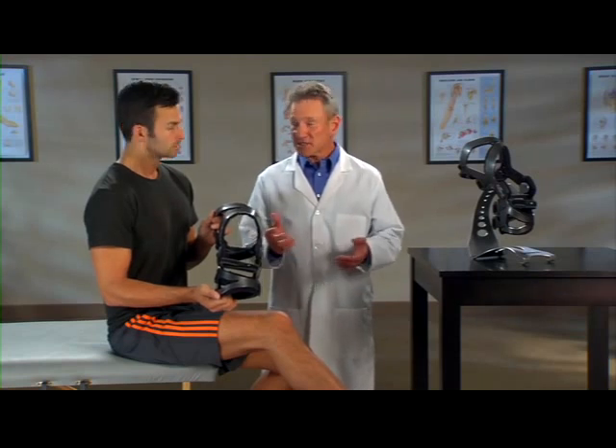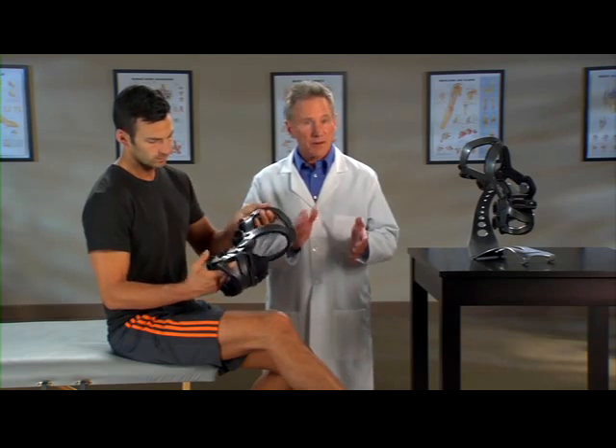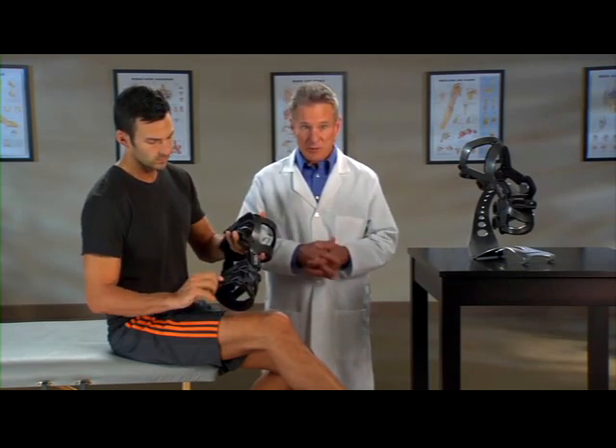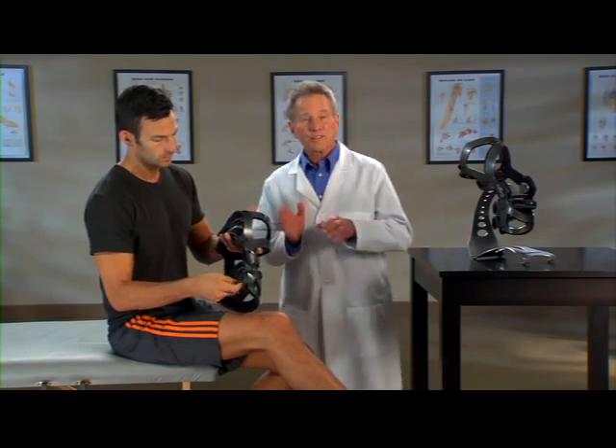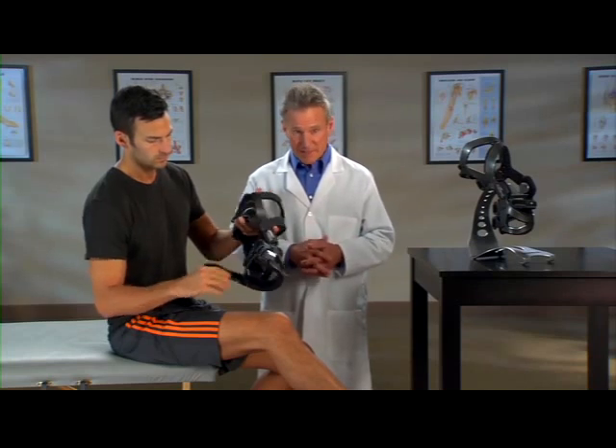The LPR knee brace is easy to put on. Start by unfastening all the straps except for strap number three, which can just be loosened. Folding the hook-loop tabs back against the straps will stop the straps from getting tangled.